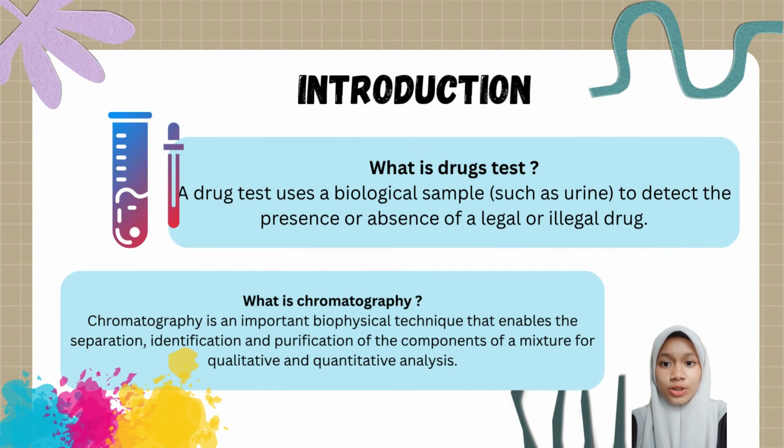Now, I will introduce two important concepts, which are drug testing and chromatography. So, what is a drug test? It is a process that uses a biological sample, such as urine, to detect the presence or absence of legal or illegal drugs in the body. These tests are commonly used in healthcare, workplace, and law enforcement.